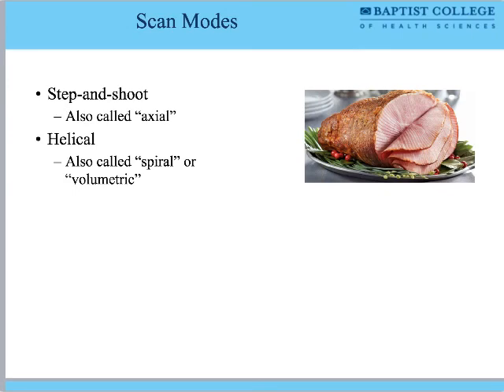So this axial thing is going to give us slice by slice through the loaf of bread. With the early technology that we had, like when we were literally putting cow brains on record turntables, that's all we had the computing processing power to handle. Like the very first CT scanner, it required almost a day to process images. It had very little processing power, right? So it was a limitation of the technology, it was a limitation of the computers that we had. We had to rely on axial scan modes.